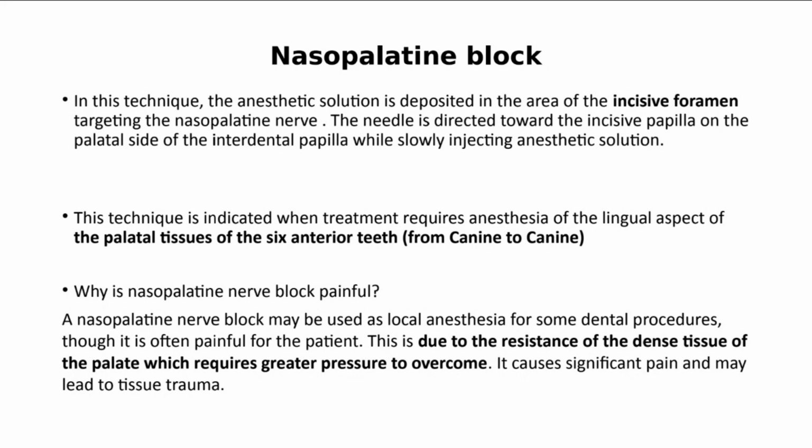So when you put the Q-tip, tell your patient, I'm sorry, this is going to be painful. It will take only a couple of seconds. And then you inject slowly. It will be painful at the beginning, usually more painful than what you're doing outside. Again, this is because of the trauma from that greater pressure.